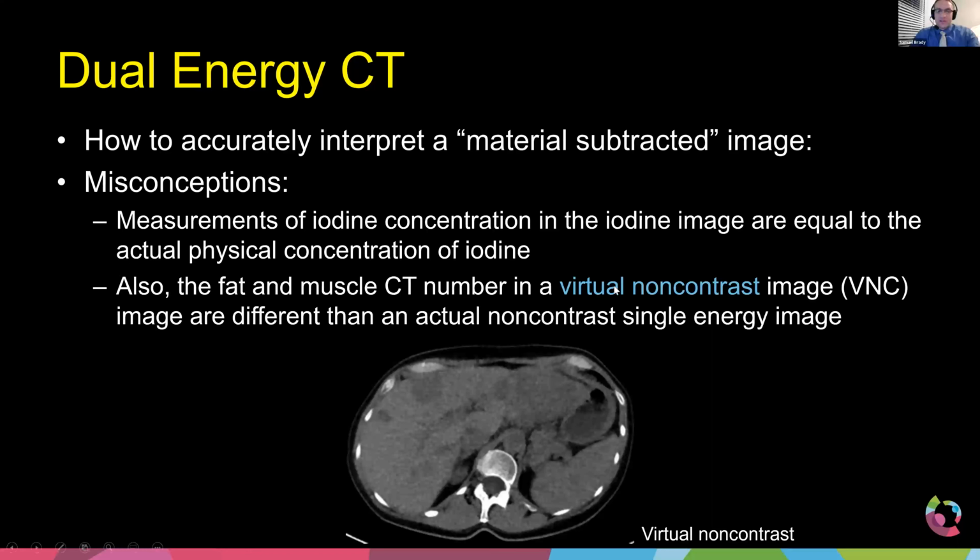Also, because of these virtual non-contrast images, when you're physically subtracting out the iodine component, all voxels in the image are a mixture of different materials.